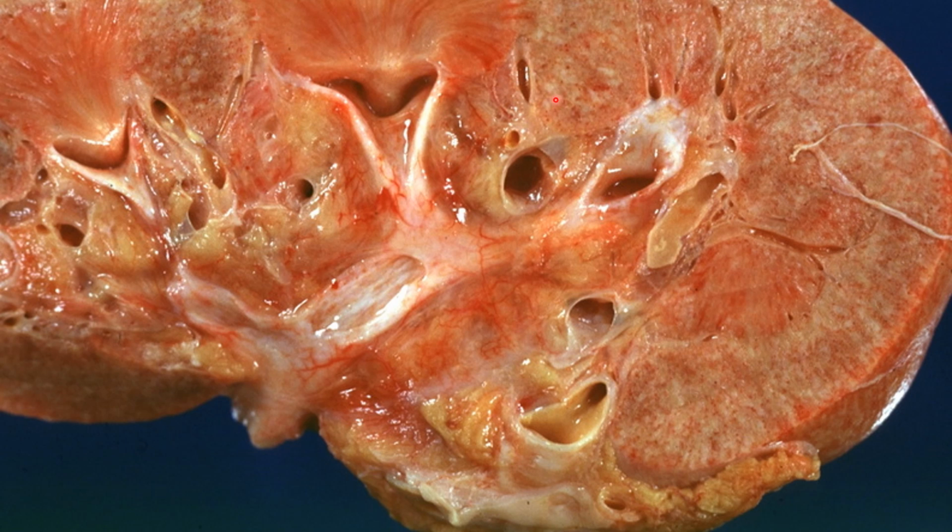We are going to look into two images and two virtual microscopy slides for this practical one. First of all is acute pyelonephritis. You can see this is a cross section of a kidney. This is the hilum. This is supposed to be the cortex and medulla.